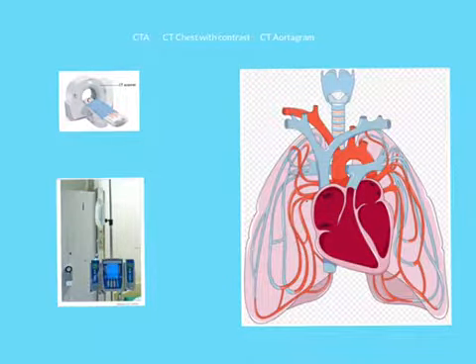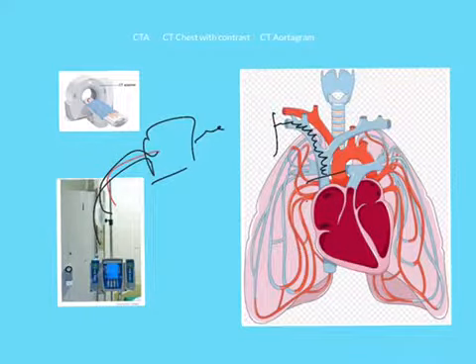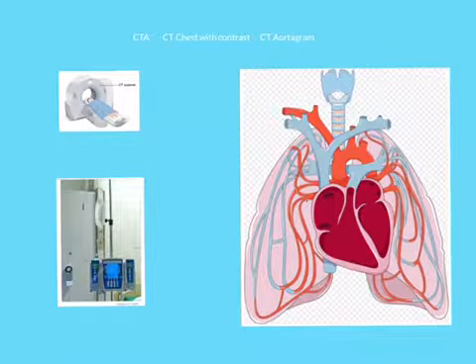So I'd like to briefly, because it wasn't clear before, give you the idea of the concept of a bolus. So the bolus comes out of the IV, and think of it as a bolus that moves along. So your bolus comes along over here, all right? And at that point in time, the bolus is coming into the right subclavian and coming into the superior vena cava over here. So now the bolus continues to move along.